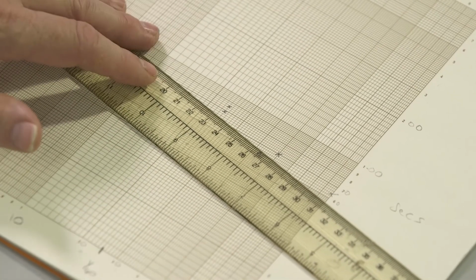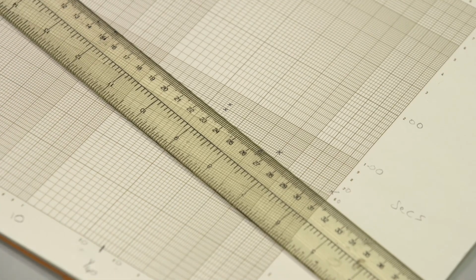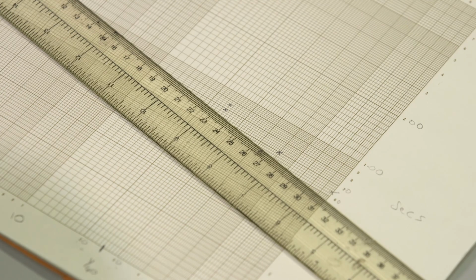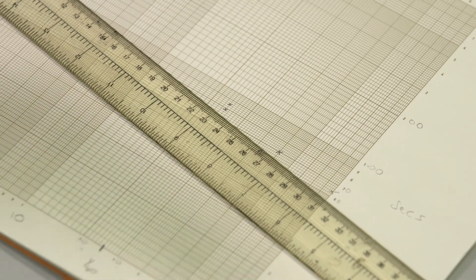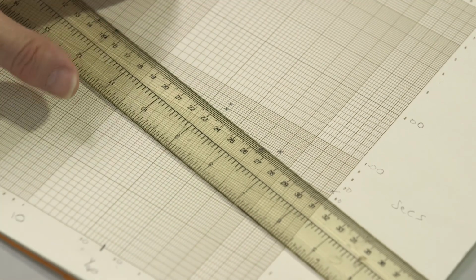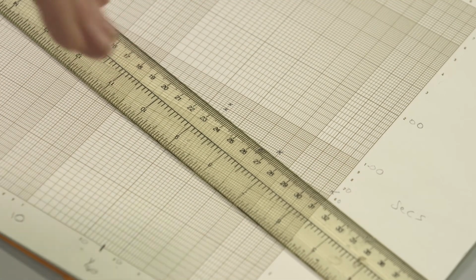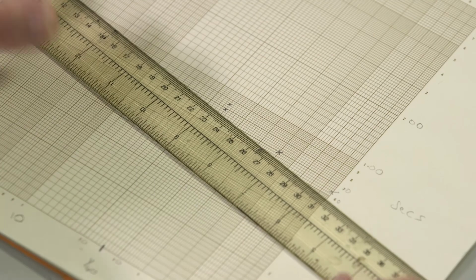And for this we now need to look, is there a straight line relationship? And that's where we need the ruler. So when this plot is made manually in this way, on graph paper, this is done visually. Of course, on an autoanalyzer, this is done automatically by the software, and on most autoanalyzers there are assessments of linearity, and this is a useful measure, and there's an advantage to run such assays for that reason on autoanalyzers. Nevertheless, the technique that we've used is precise enough for patient management purposes and can be used.